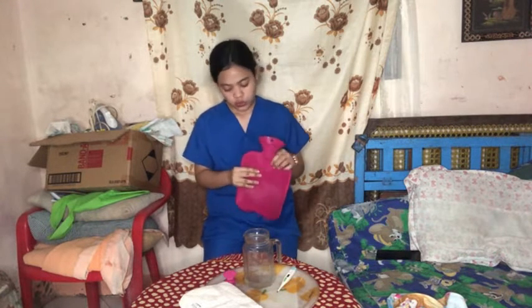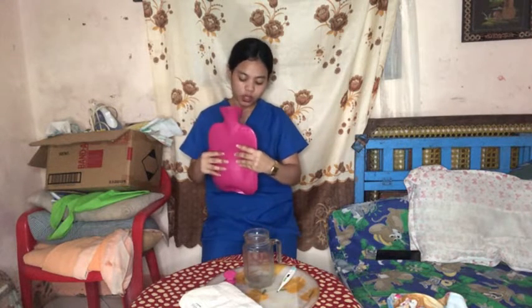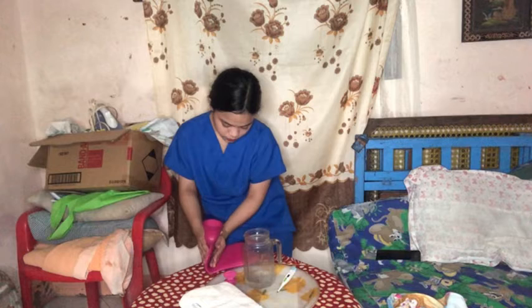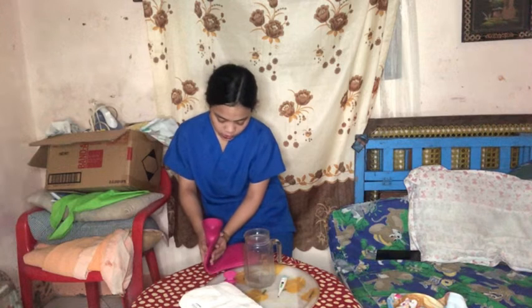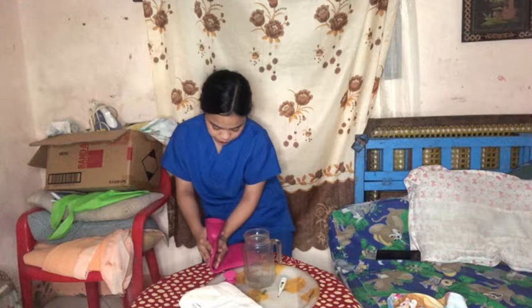Okay, then next we are going to expel the remaining air and secure the top with the air removed. So we're just going to fold this hot water bag to expel the air. The air flows outside from the mouth of the hot water bag.